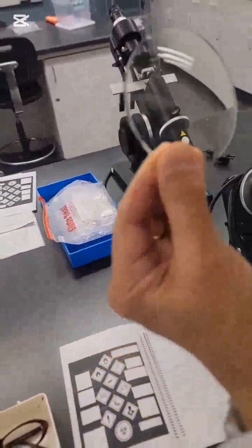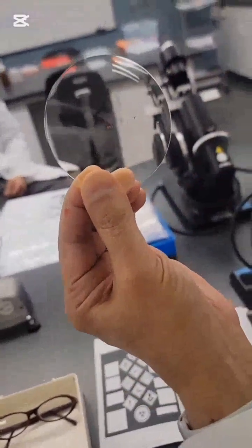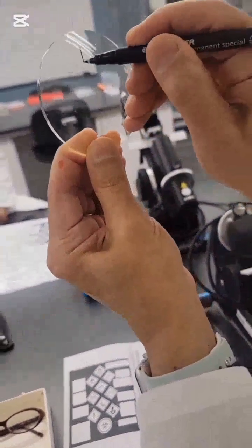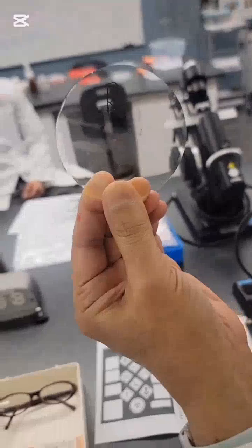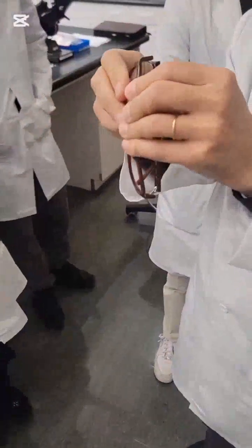The 3 dot on the lens is your 180 line. Connect the dot using a white chalk marker. To properly identify the lens with the help of white chalk marker, right are on the top of the lens. Repeat the same thing for your left lens. Now take out the demo lenses from your frame.